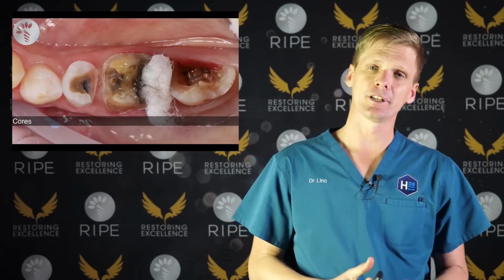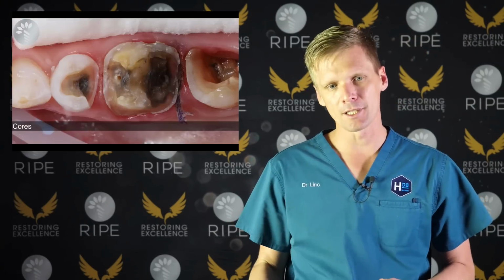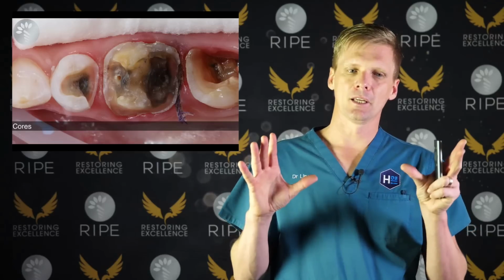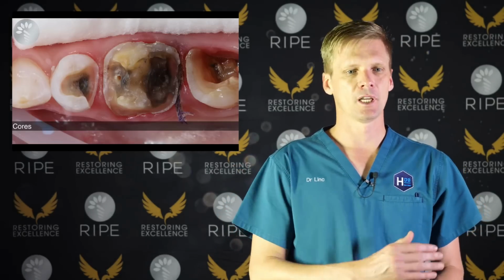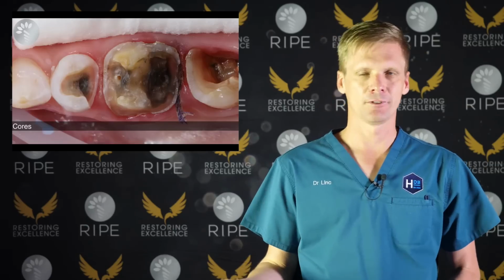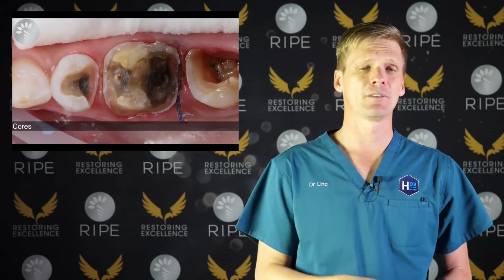Now, there is a lot of stain on this tooth. That's silver oxide, that is not caries. But you can see that this tooth is perfectly dry. So there's fluid on the tooth behind, but there is no fluid coming up over that margin.